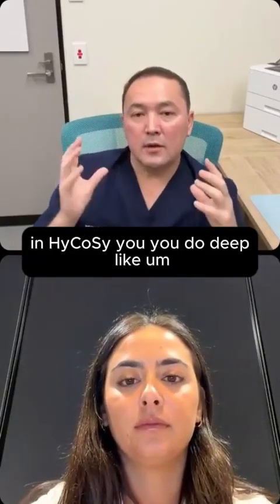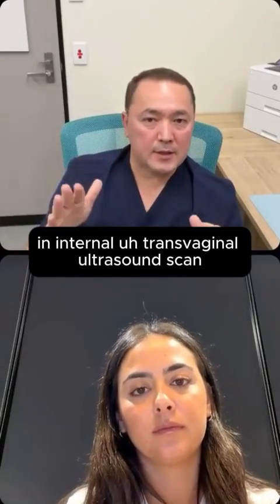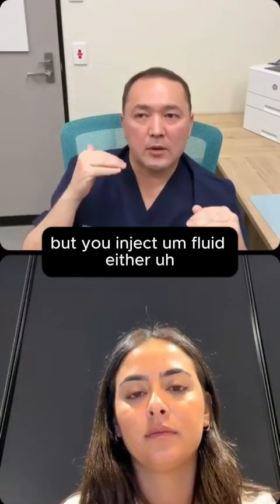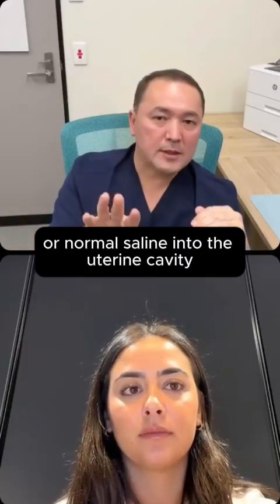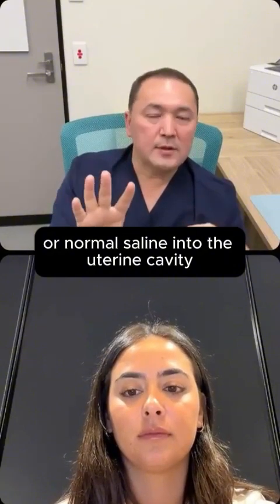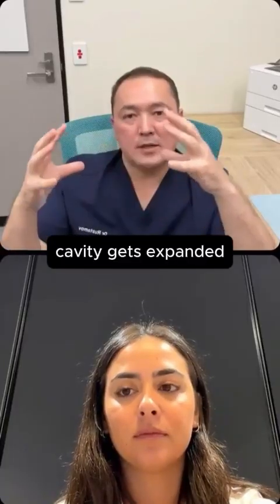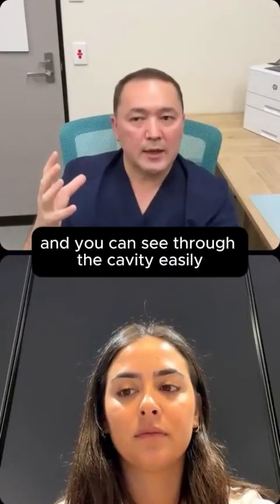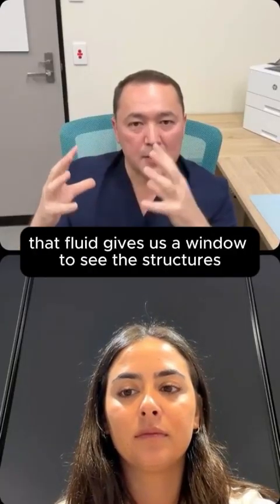In HyCoSy, you do an internal transvaginal ultrasound scan, but you inject fluid, either contrast fluid or normal saline, into the uterine cavity while you are scanning. When you inject the fluid, the cavity gets expanded and you can see through the cavity easily. Wherever there is fluid, that fluid gives us a window to see the structures.